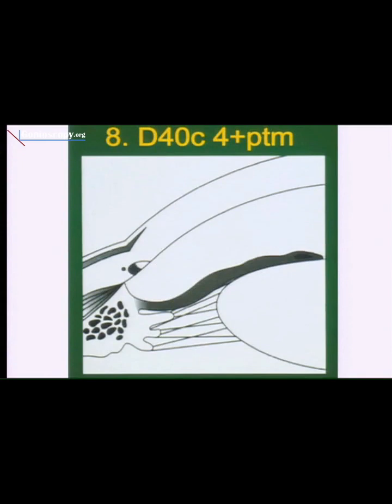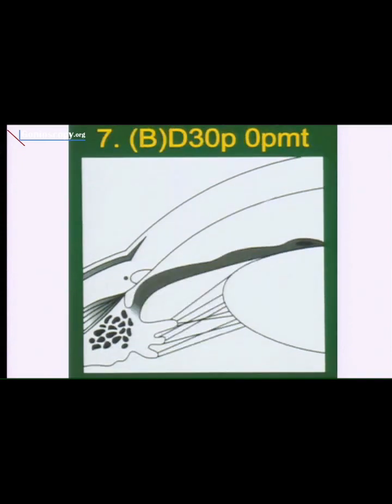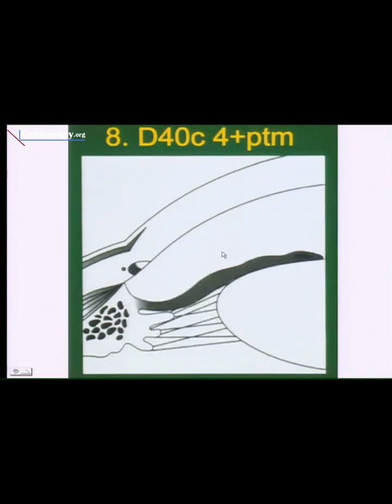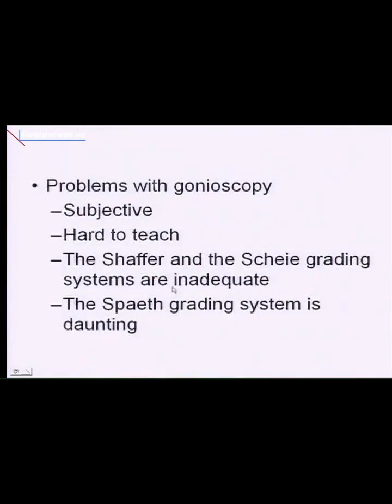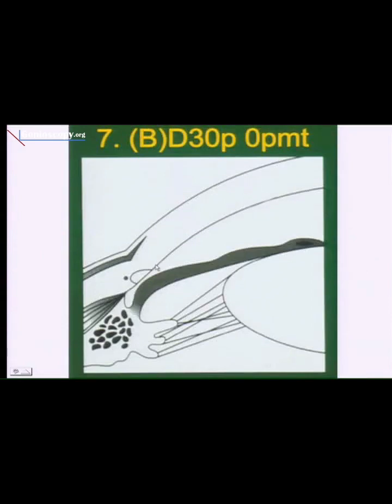Okay, let's go back now and hypothesize for a moment. Let's say the angle, instead of coming up like this, went right across like that. What would that be graded? Plateau? No, that's not plateau. The angle sticks there and goes right across it. This is a plateau. What would it be if it's stuck there and just goes right across like that? A, 40, F. A40F.